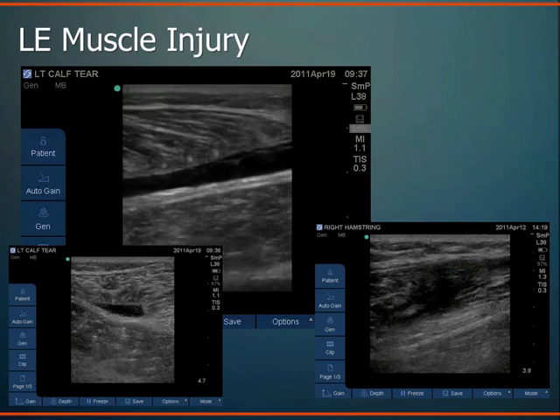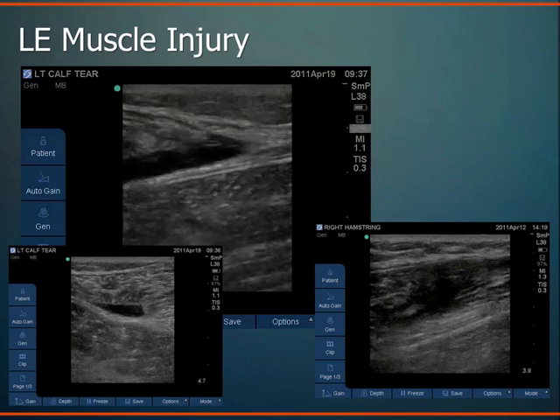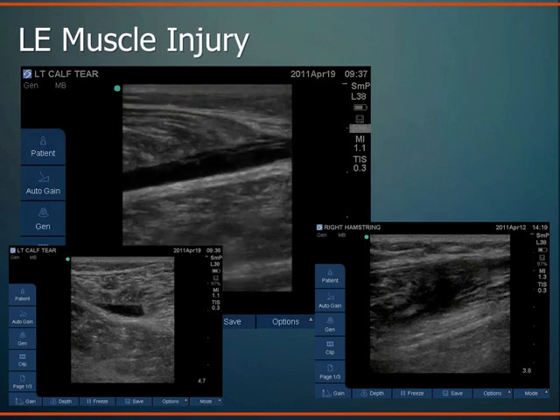Yeah, and what's nice is, when you're aspirating, not all of them are straightforward. Is this infection? Is this gout? Is this just arthritis? Is this acute hematoma? A lot of different things can cause a joint effusion. So if you need to aspirate that fluid, it's very easily identified. Okay, that's where the suprapatellar pouch is. There's the swelling. Stick the needle right there, and you're right on it. So it's very easily visualized and very applicable to a clinical setting.